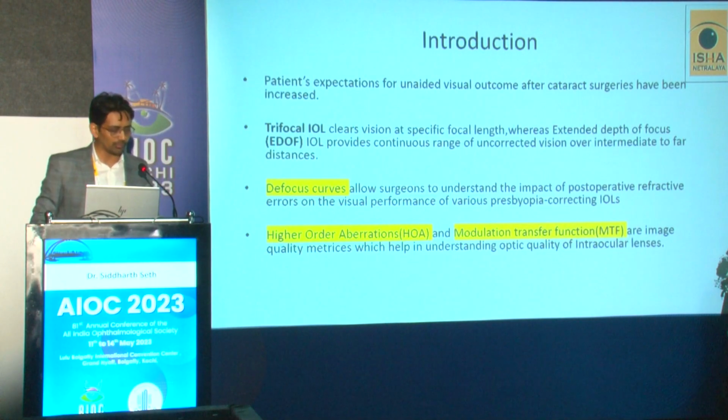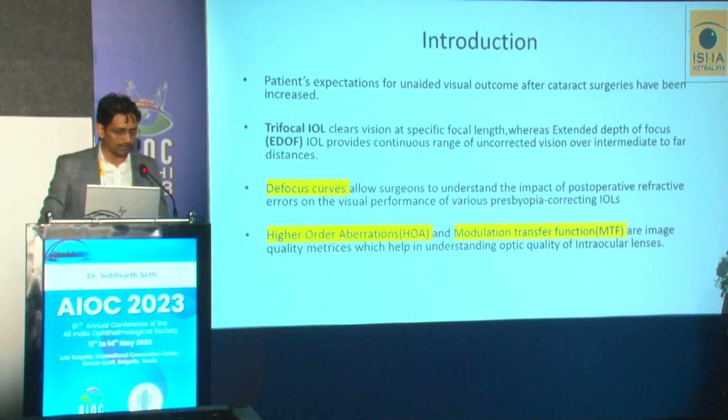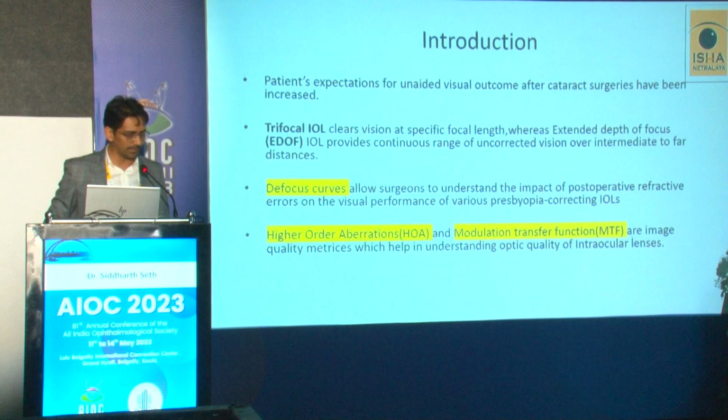One of them is the defocus curve, which allows surgeons to understand the impact of post-operative refractive errors, which sometimes happen even despite perfect biometry, on the visual performance of various presbyopia correcting IOLs. Higher order aberrations and modulation transfer functions are image quality metrics, which help in understanding the optical quality of various intraocular lenses.